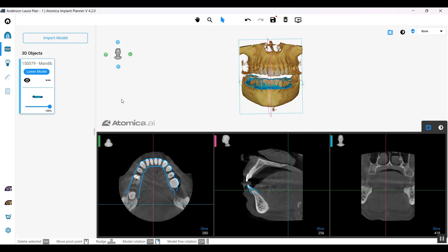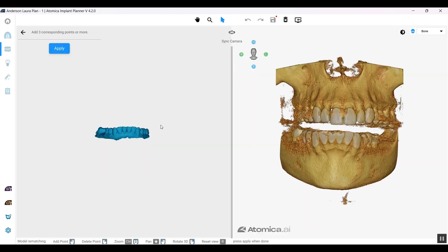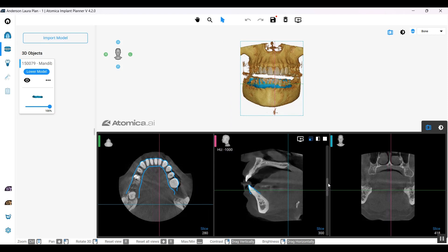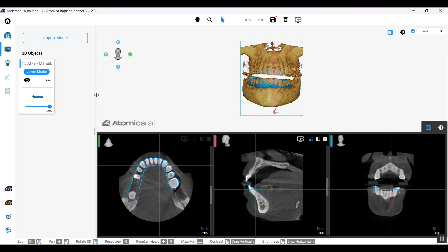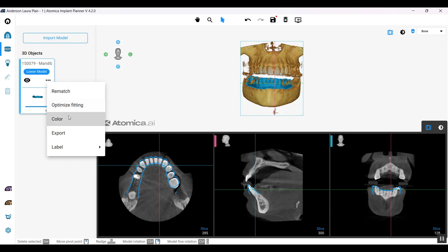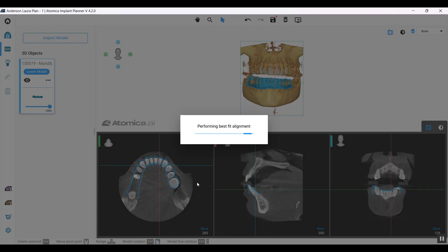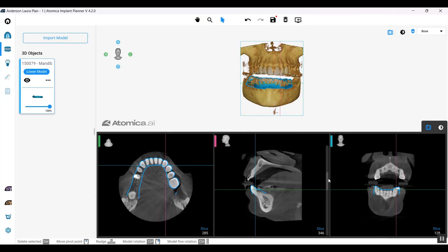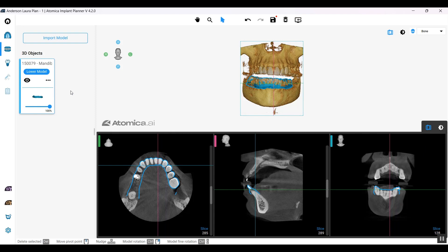In case it didn't fall into place, you also have the alternative option, which is the conventional way of rematching the model to the scan. We have another feature that will be helpful if your model is pretty close to the ideal position. All you need to do is tap on the three dots and tap on Select Optimize Fitting, and it will optimize the fitting of your model to the scan. As you can see, it brought it back into place.